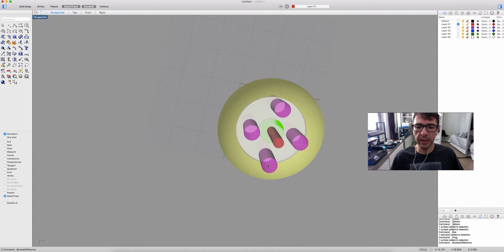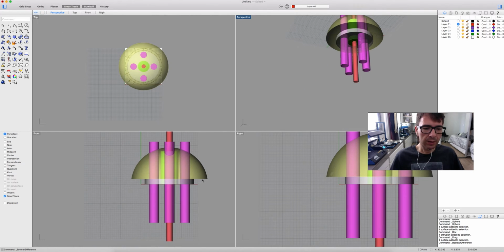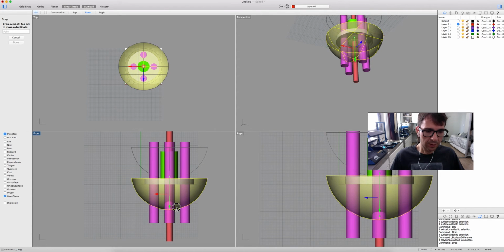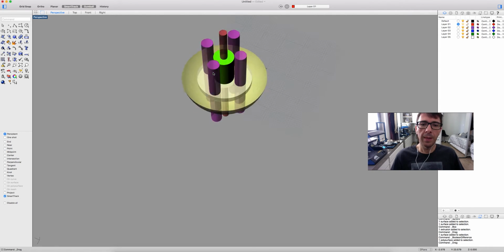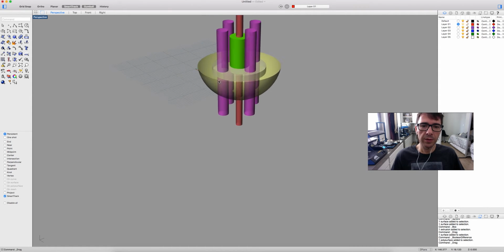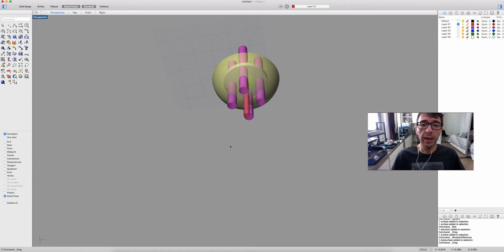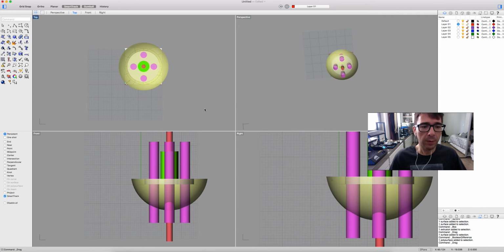We have the base plate, the glenosphere, and the central pin guide. The glenosphere is on the other side, so let's rotate it 180 degrees and move it to the correct location. Now it's okay. As you can see here, now we have our glenosphere. It's a 38 glenosphere. We have our base plate, our peg, our central pin guide. And if we want to plan the surgery, it's quite easy.